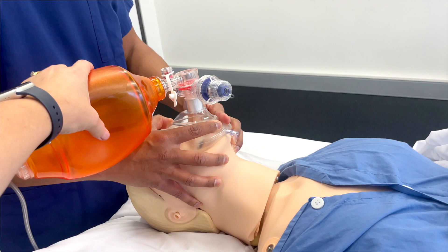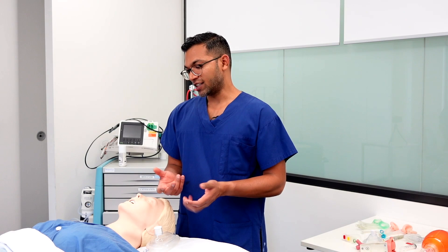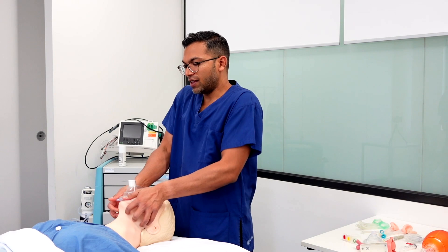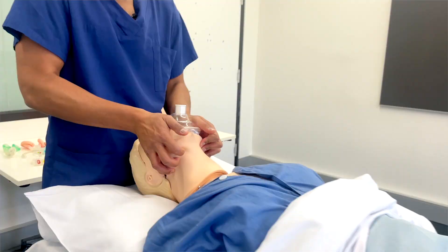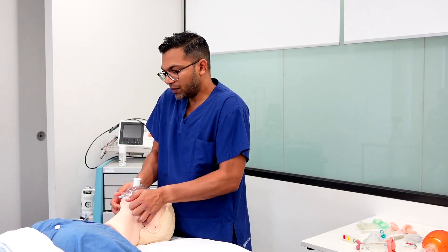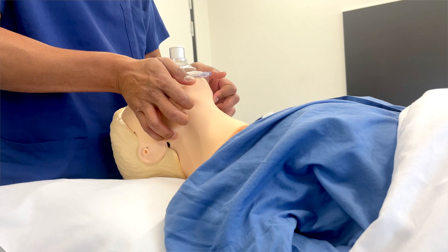If you have small hands or your hands are fatiguing, a really good option is to use your palms — that gives you all four fingers to lift up the jaw, using the intrinsic muscles of the hand rather than just the fingers. So I'm lifting up with fingers and pushing down with the palm, providing a strong jaw thrust and good access. Using your whole palm gives you much more strength.